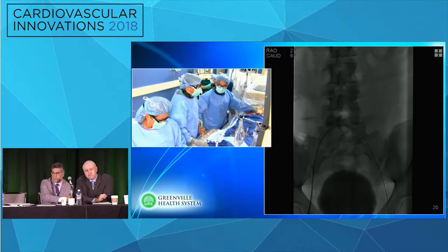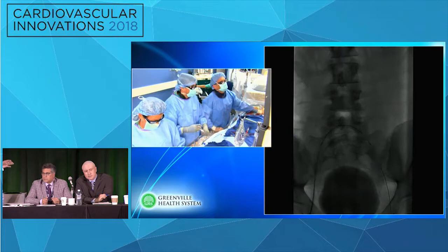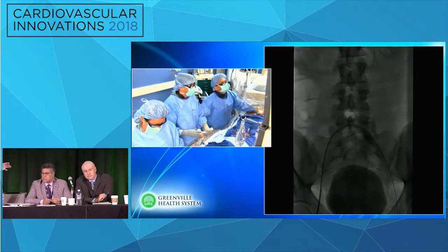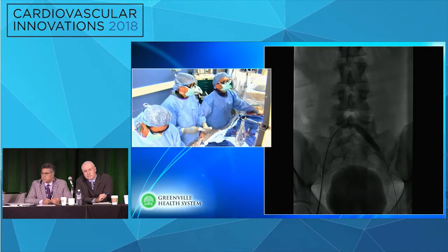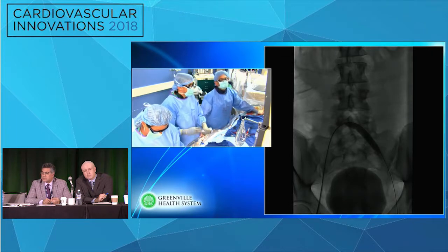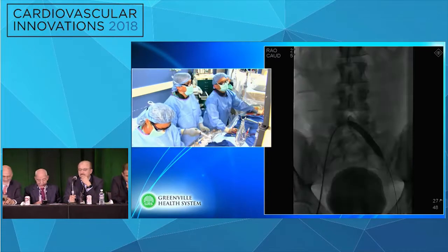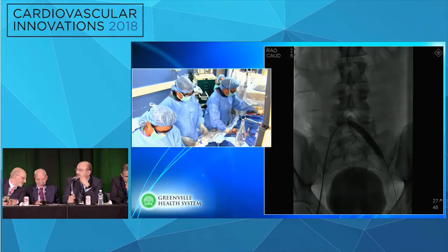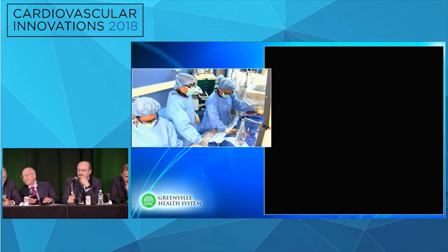I think we are all advocating covering the ostium. The question is whether you will extend it into the body of the IVC and cover the origin of the right common. Tony, you would go into the IVC then? I don't think you need to jail the whole. So Bruce, Michael Bacharach, Steve and I are for just covering the ostium, with a few millimeters into the IVC and not completely jailing the right. But most of the other panelists suggest that you go into the distal IVC and jail it, and it shouldn't be a problem. What's your thought?